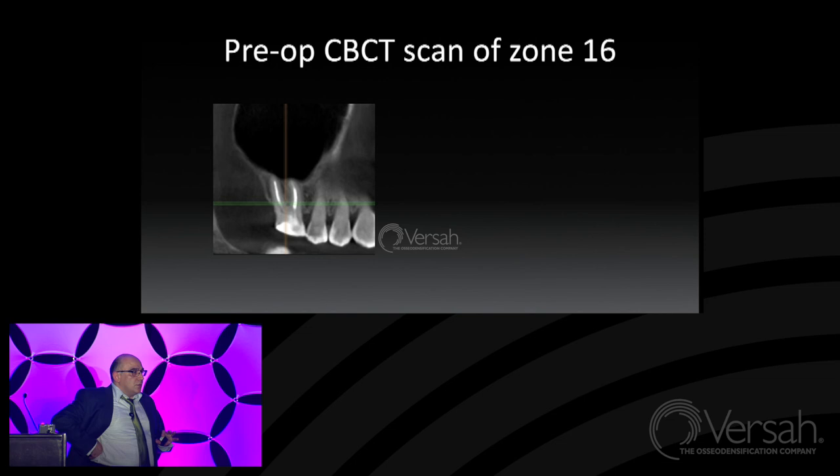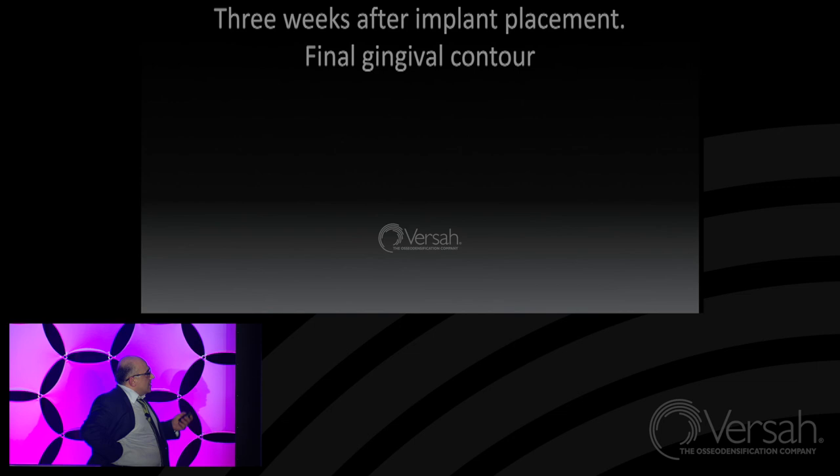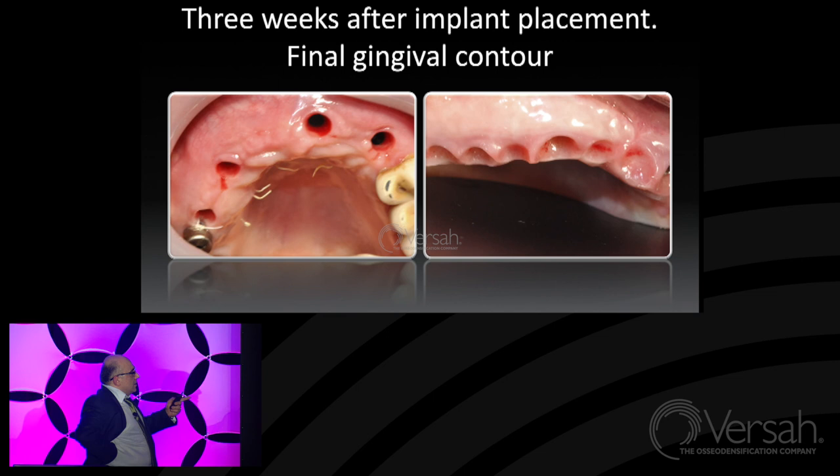It's very interesting. Soft tissue enhancement mimicking the nature. That's the idea of all my lecture. And we make some surgeries, place the implants, 5 implants on the upper jaw. And this is the view of upper jaw at 3 weeks after the surgery. We see deep horizontal mattress suture is still there. And that's what we got using these dynamic compression techniques.